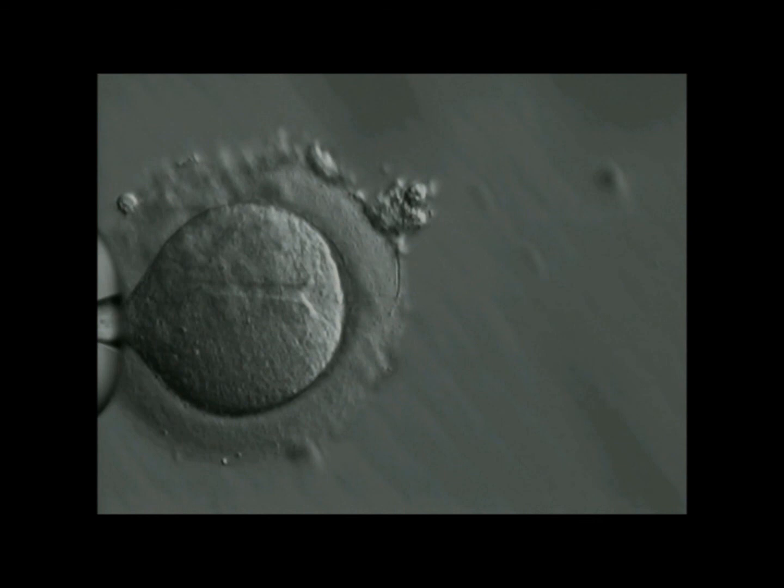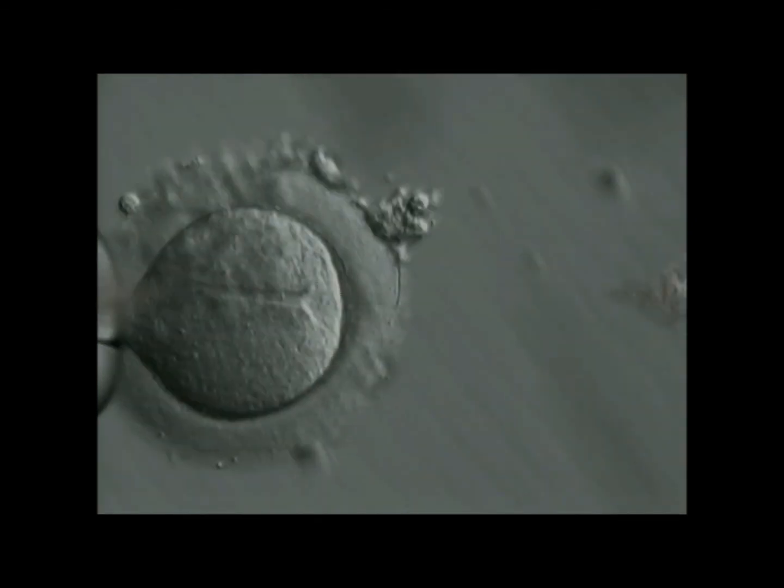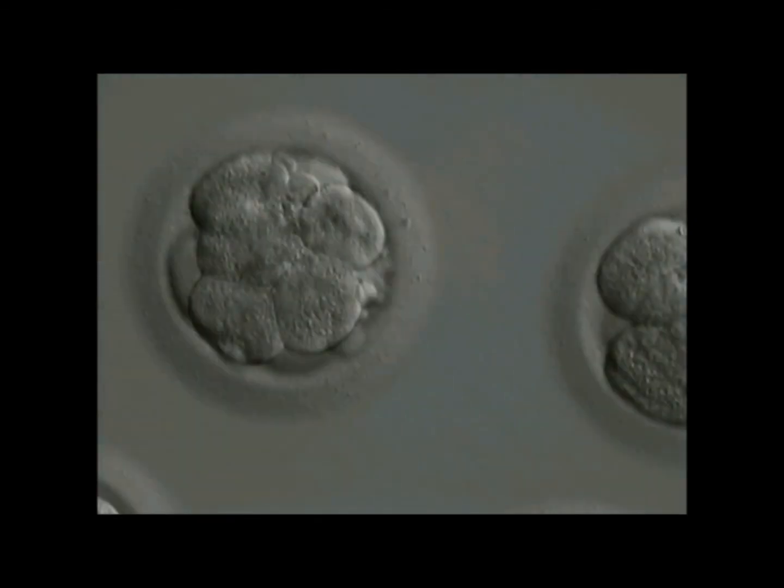Here you see the result of ICSI, two beautiful embryos. The embryos were transferred on day five into the womb and resulted in twin pregnancies.